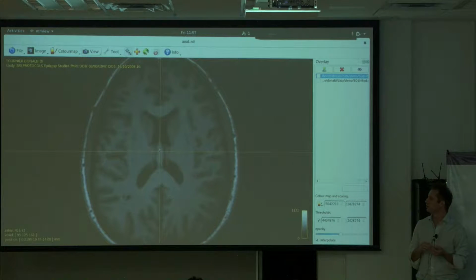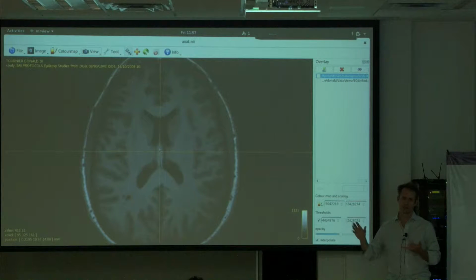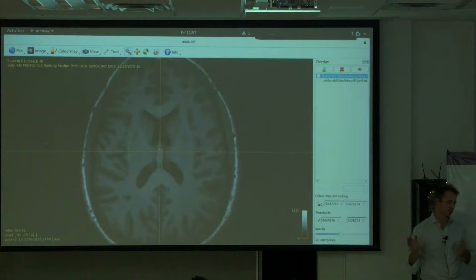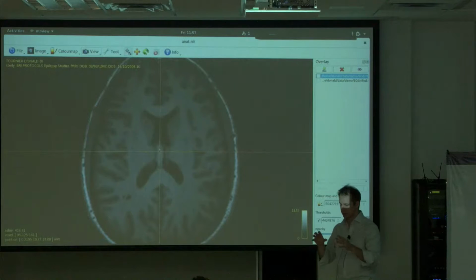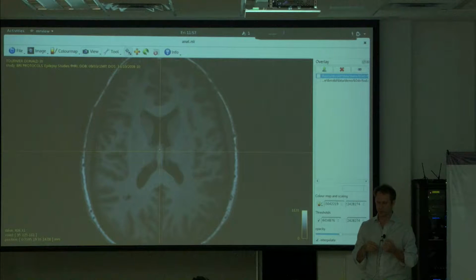So for the hardware, I typically on Linux would recommend NVIDIA, but ATI is catching up on the driver as well. So there's not much in it. If you want to run ATI, it's fine too. Okay, now coming back to the general hardware. So that's just a minimum to get MRtrix running and to do general processing.